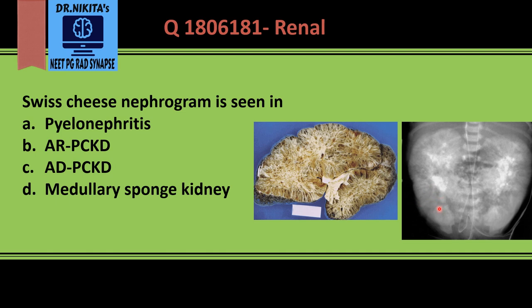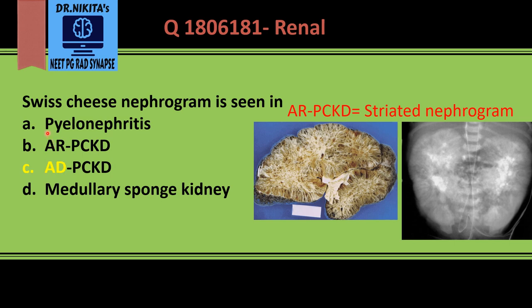This is a newborn IVP where both kidneys are enlarged and there is striated nephrogram bilaterally — so this is autosomal recessive. To summarize: autosomal recessive polycystic kidney disease gives a striated nephrogram, while autosomal dominant polycystic kidney disease gives a Swiss cheese nephrogram.